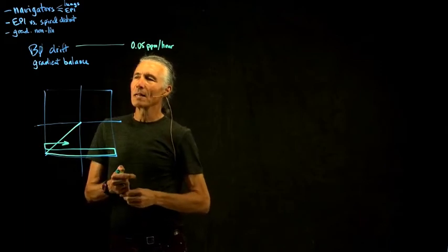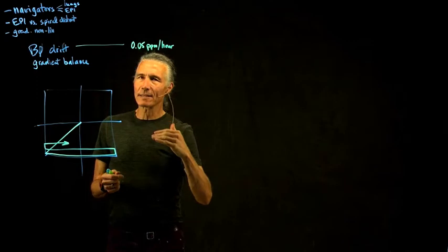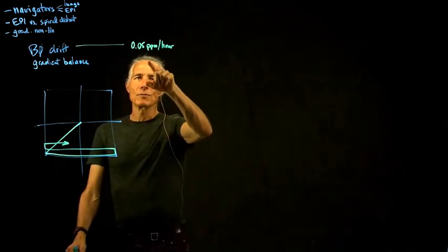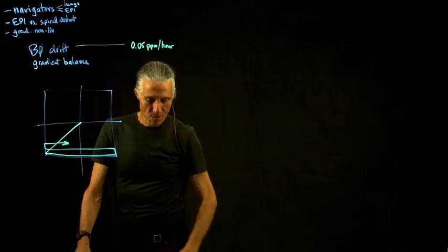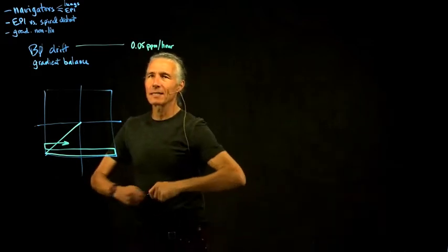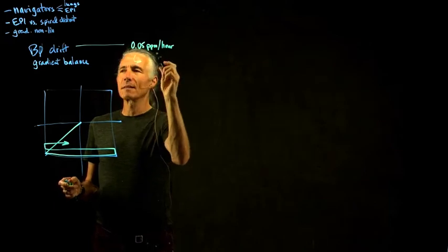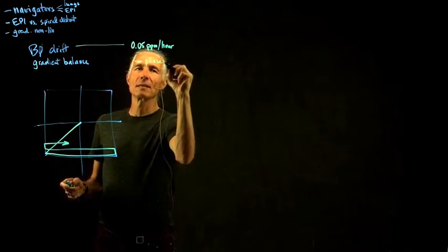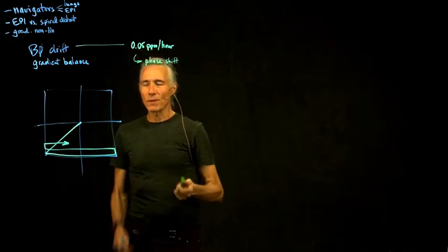It's actually enough of a problem that within a 5-minute scan, the B0 will drift down enough to cause an image shift. So how does it cause an image shift? If this is unaccounted for, it will cause a phase shift, because the precession will be slightly different than what we were expecting.